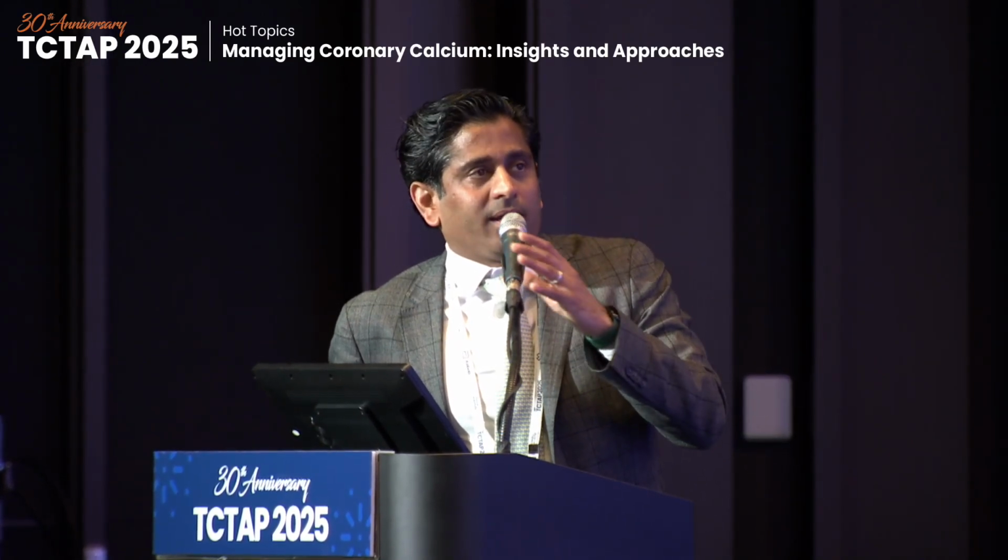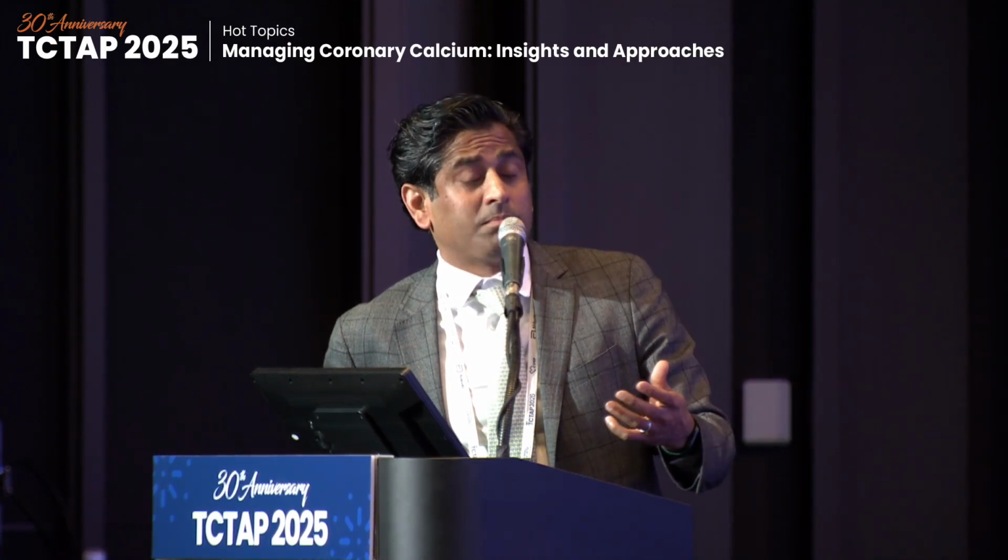Yeah, again, there is hardly any data in the literature on this. So I'm thinking maybe in the future we should start looking at DCB in those, especially eruptive nodules, because it's much more expandable. You're making more fractures. Maybe the drug goes in better than in non-eruptive nodules. Because, as you said, once you put a stent in, and if it fails, it's very difficult to treat that. But a calcified lesion is not a contraindication for DCB. I'd like the other panelists' opinion about your... Yes, so Dr.